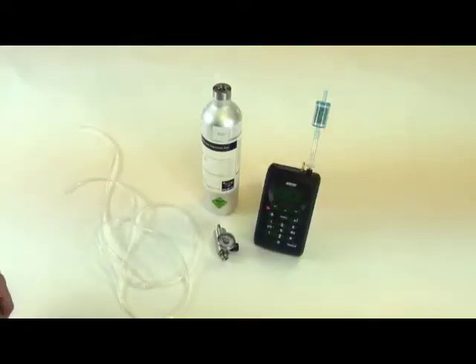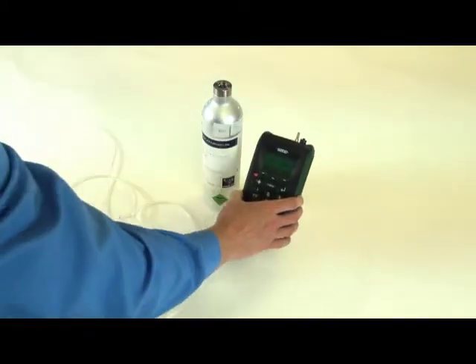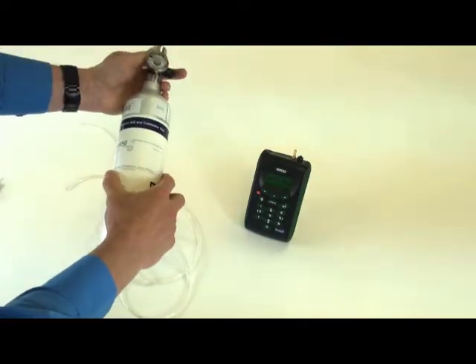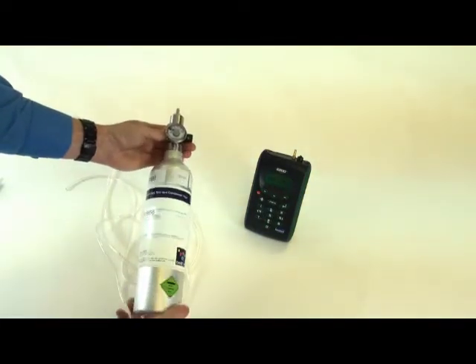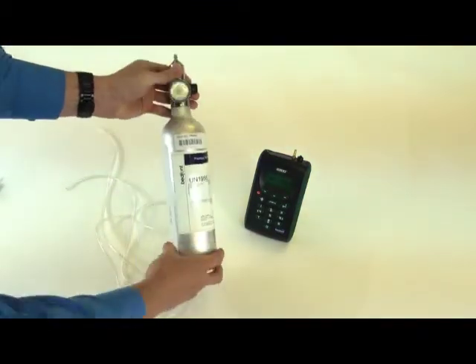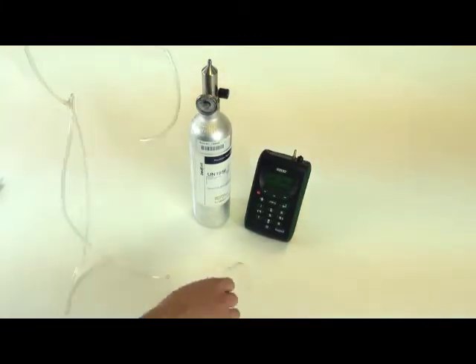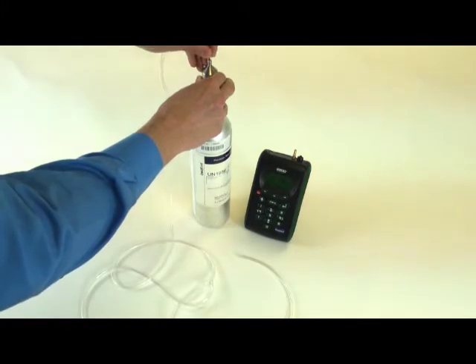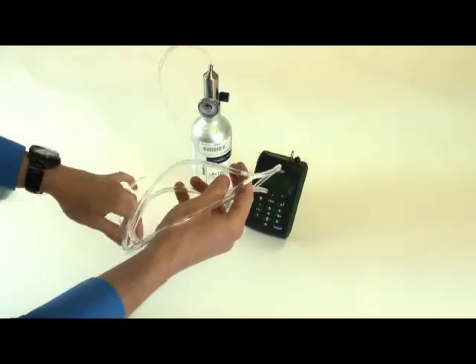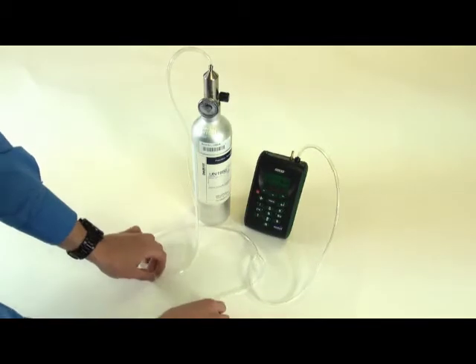To perform a full calibration, you will need the N2O calibration gas, flow meter, and the calibration tubing supplied from Bedfont. Remove the filter as seen here. Next, screw the flow meter onto the gas canister, ensuring it is on tightly and that you haven't crossed the threads. Then attach the calibration tubing to the flow meter. Bedfont advises that the exhaust tubing should be at least a meter long.